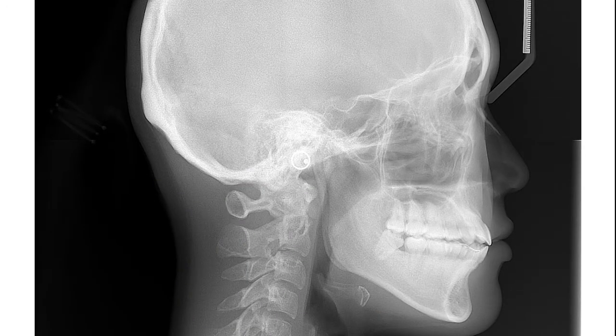The significance of cephalometric radiography, as opposed to routine skull radiography, was standardization of the technique and reproducibility of the images. The patient is positioned in a cephalometer or cephalostat with ear rods placed as a head-holding device. The distance from the X-ray source to the patient's mid-sagittal plane is fixed. The distance from the mid-sagittal plane to the cassette will be the same for each individual patient. Thus, repeated exposures may be made on successive occasions under standardized conditions.